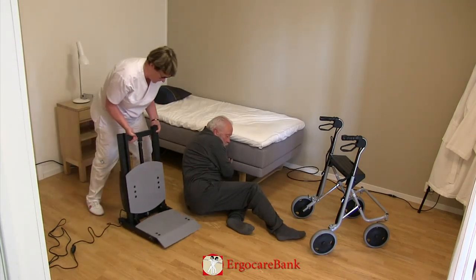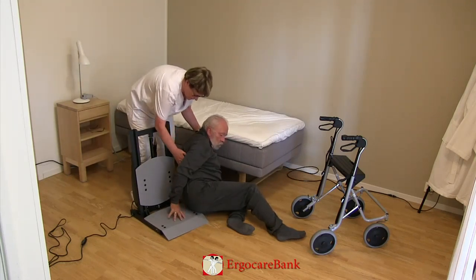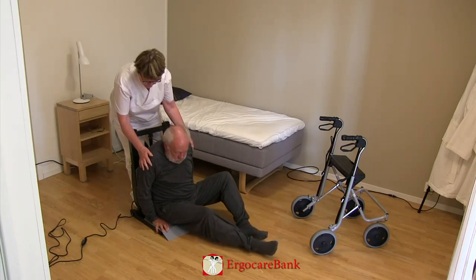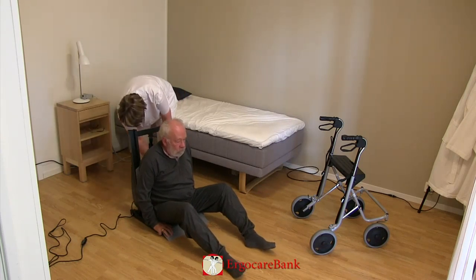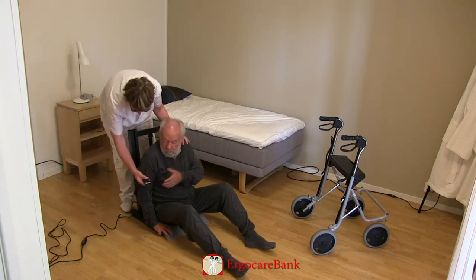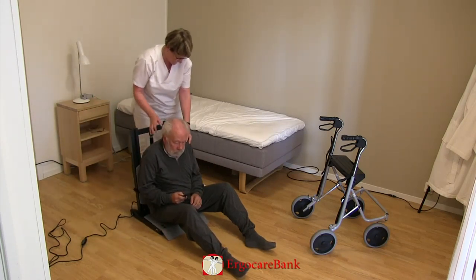The staff member puts the seat of the stand-up close to Bert's bottom and instructs him to push himself up onto the seat. Bert is then given the control for the stand-up and can raise the seat himself.